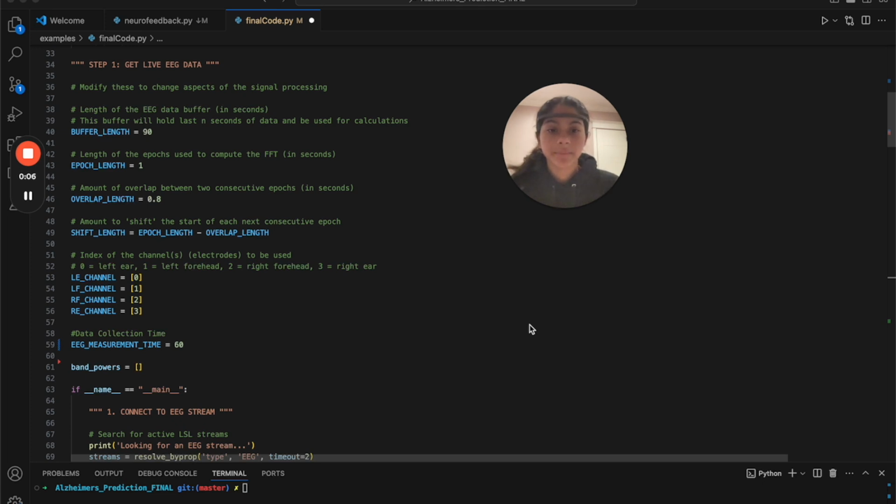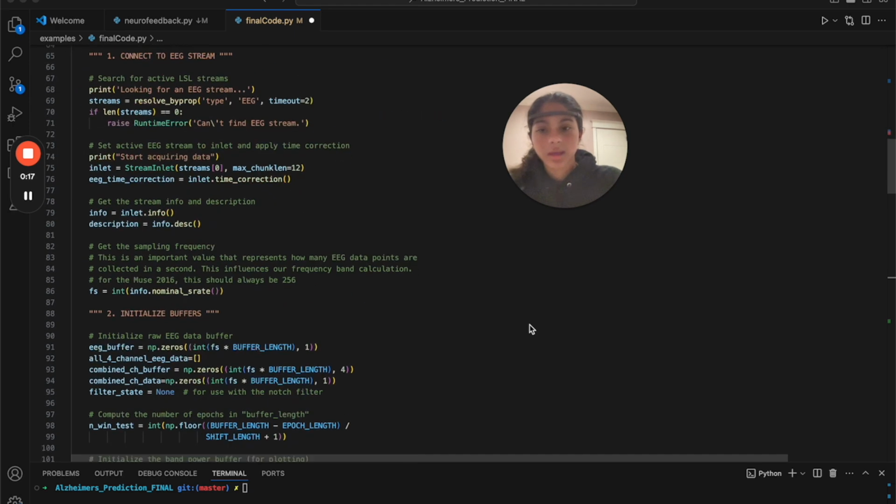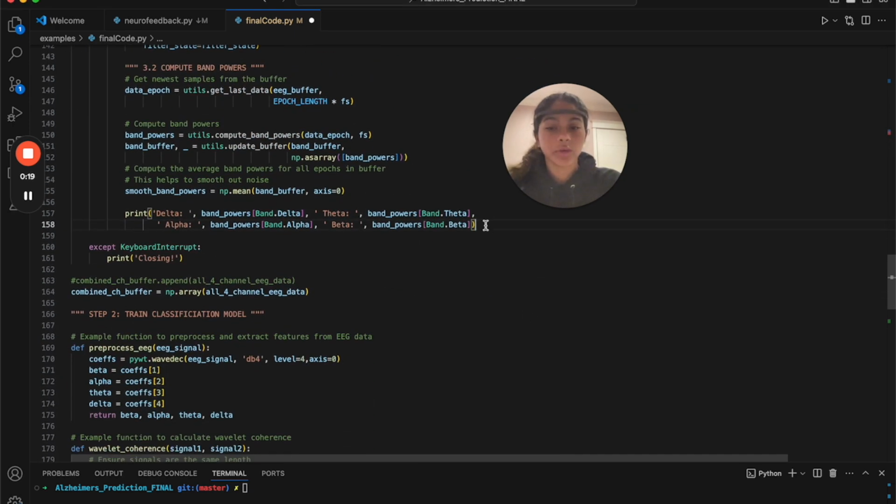So the first step is to get our live EEG data. And I forked this step's code from the Muse LSL repository, which there's more information about in the article if you want to check it out. But the key thing here is we're going to be using 4 frequency bands, alpha, beta, theta, and delta, to help us predict Alzheimer's. But how?